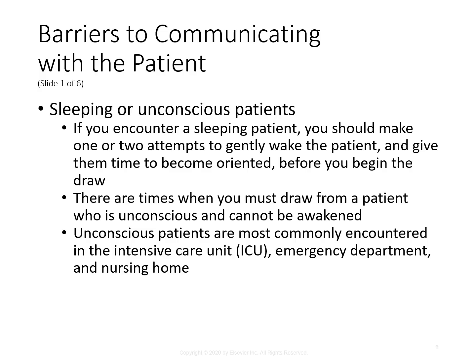Lots of times, obviously, if they're unconscious, they can't respond to you, but a lot of times they can still hear you. That is why it's important to still assume that they are conscious, tell them what you're doing, and introduce yourself, because I could only imagine how scary it would be if you're not able to verbalize, you're not conscious, but you can still hear what's going on, and all of a sudden, you feel pain. So just keep that in the back of your mind when you are with these patients, or really any patient at any point.